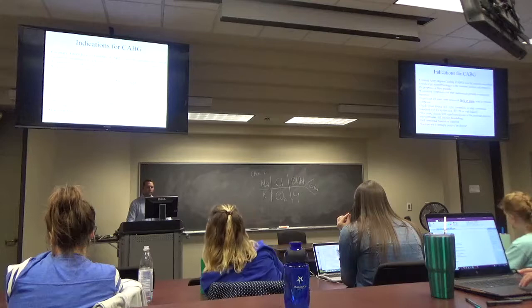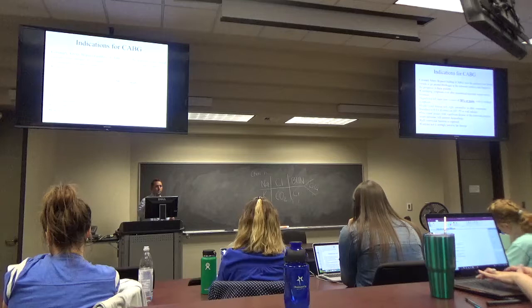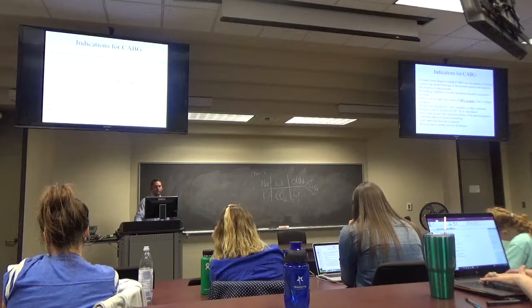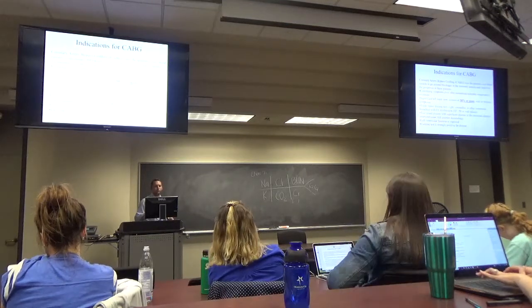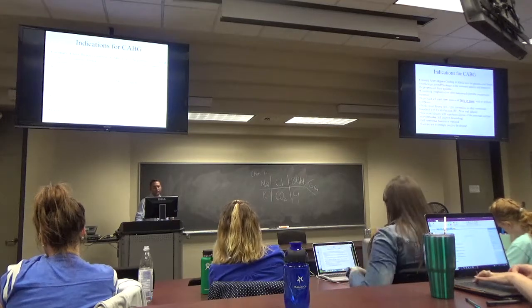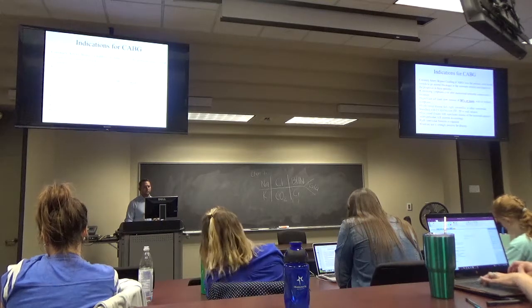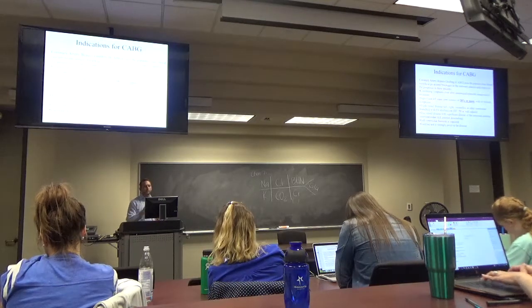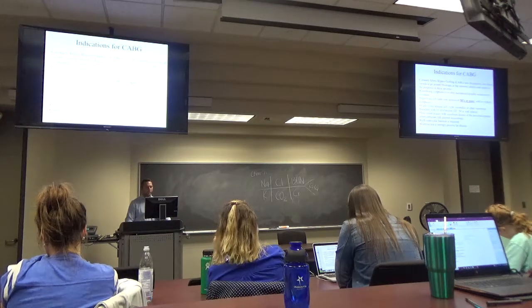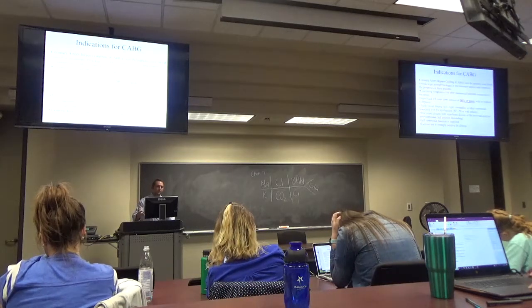And then this is on the other side. This is what a cardiothoracic surgeon would do. This is CABG. We were talking about it earlier with those median sternotomy wires. There are two real main reasons for it. One of them is triple vessel disease, which is the main reason. If you have diffuse disease throughout your heart, you're not going to be able to go in there and stent everything. It's just not going to work. Trials have shown that everything's going to restenose and you're going to have problems. So that's a main indication for CABG.